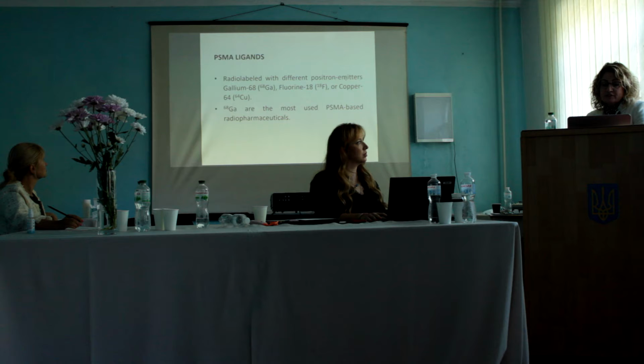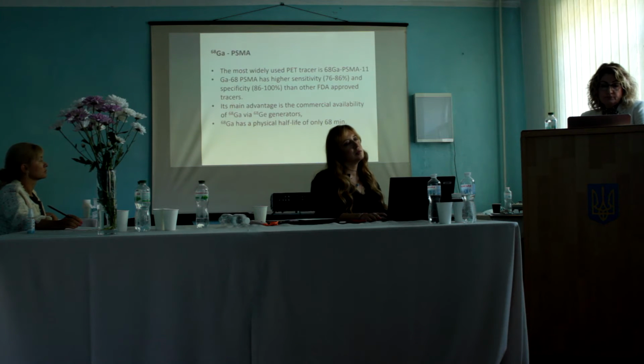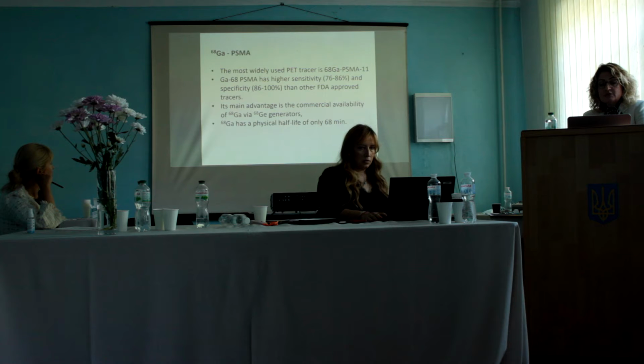Several PSMA ligands, slightly different in chemical structure, are commercially available for diagnosis and therapy of prostate cancer. This molecule may be radiolabeled with different positron emitters, such as gallium-68, fluorine-18, or copper-64. Gallium-68 is the most used PSMA-based radiopharmaceutical worldwide. Several radiolabeled small molecule inhibitors of PSMA have been designed. The most widely used PET tracer is gallium-68 PSMA-11. Gallium-68 PSMA has a higher sensitivity and specificity than other FDA-approved radiopharmaceuticals. Its main advantage is the commercial availability of the germanium-68 generator, and the gallium-68 half-life is only 68 minutes.